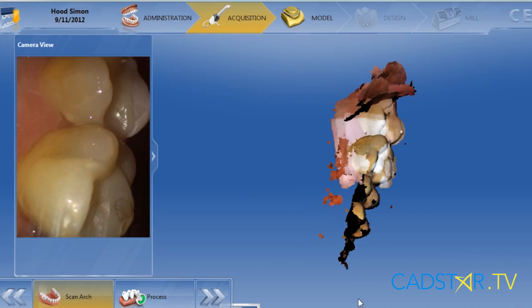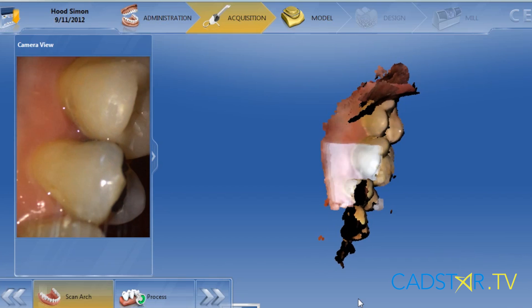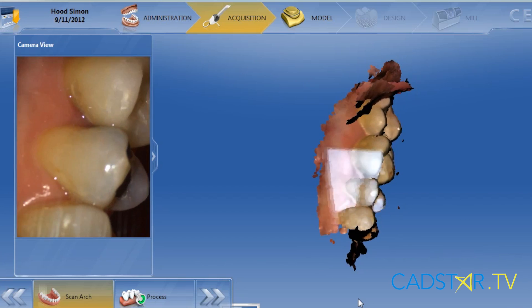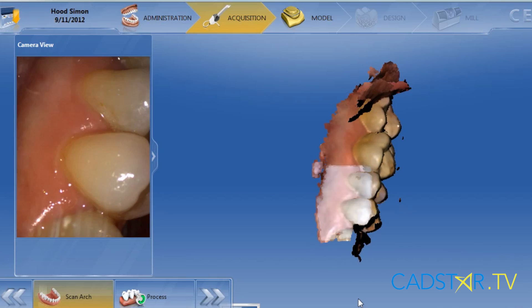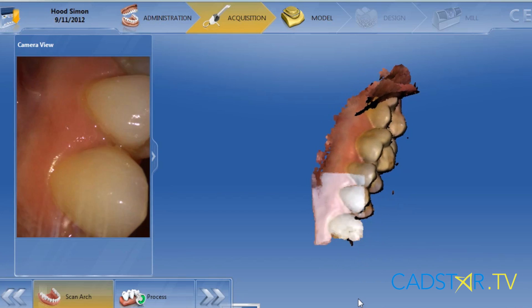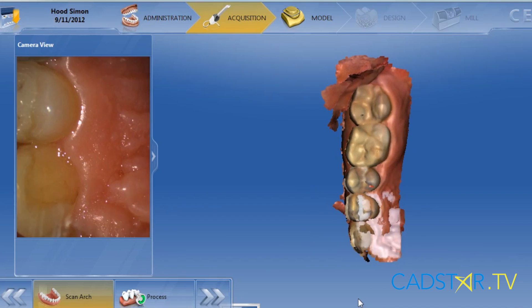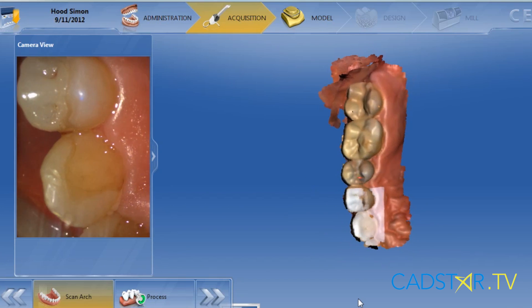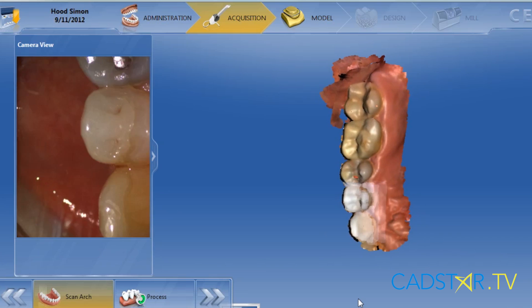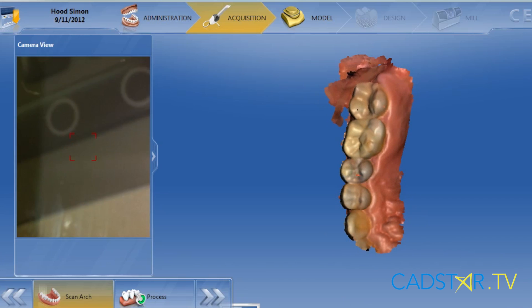We'll see that again on the buccal. We're going to start on the distal and you'll notice that I'll touch the teeth with the sapphire lens and it won't scratch. Then I back off about eight millimeters and pump it in and out as I build. You'll see that the die will build quicker that way. With the blue cam we took the least amount of images possible. With the Omnicam you can take as much streaming data as you want — it will be compressed later on to build the die.